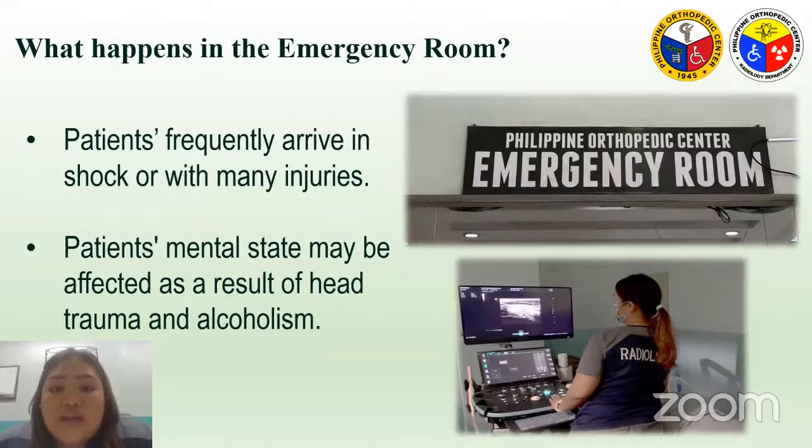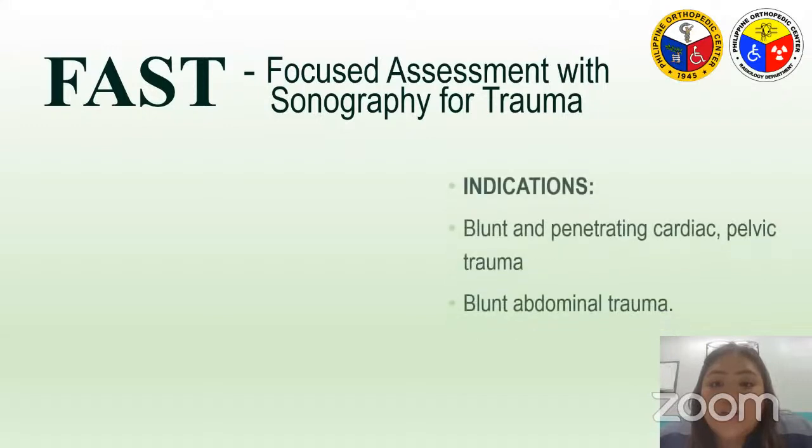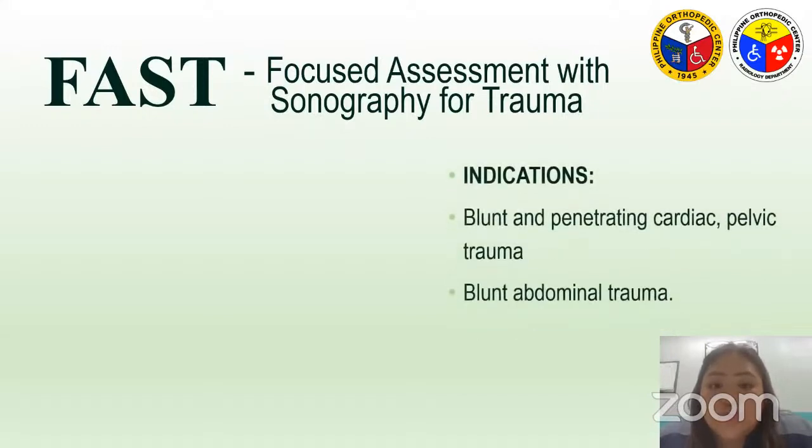only through physical examination. So when a patient comes with severe injuries, the doctor in charge usually requests a FAST ultrasound examination for the patient. The common indication for this is when the patient has blunt or penetrating cardiac, pelvic, and abdominal trauma.